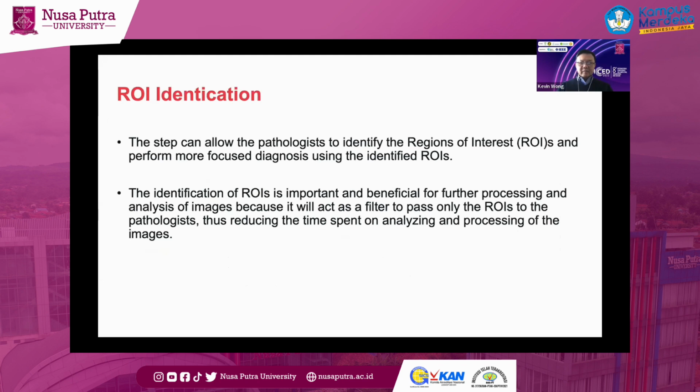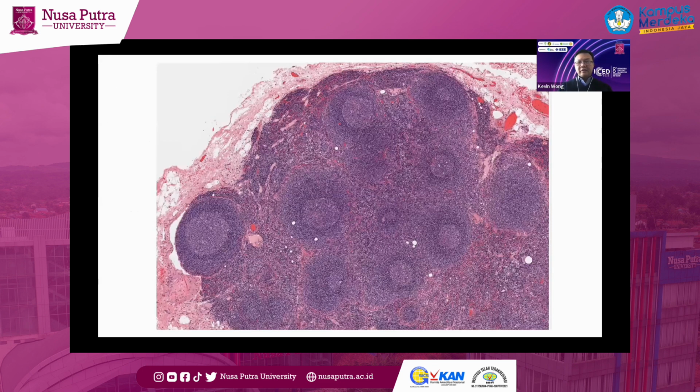I think just now I have more or less described why in digital pathology, the pathologists are interested in the region of interest, so I'm not going to go through that again. The whole idea is to zoom into the region so that they can analyze the specific area. I'll just use this to illustrate. If this is a WSI given to an algorithm, it should be able to do the same thing as what a human does, which is to identify the region of interest. So this is the first step.